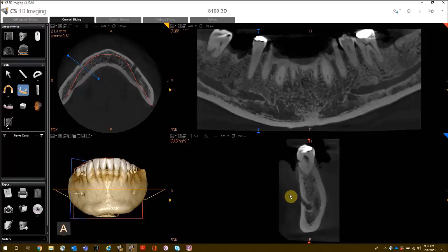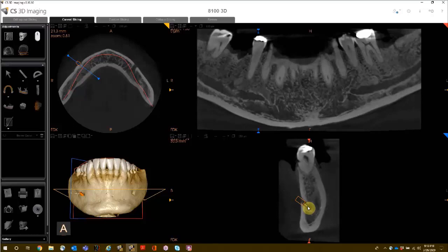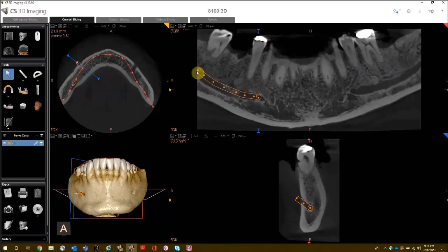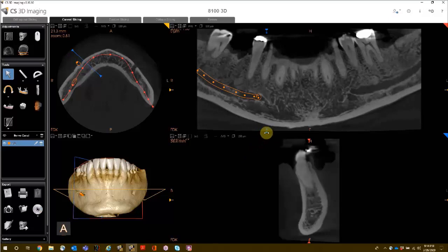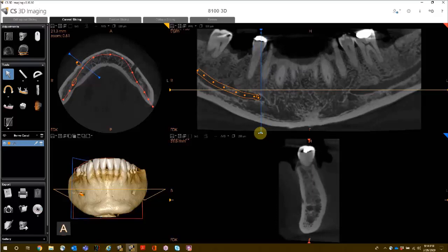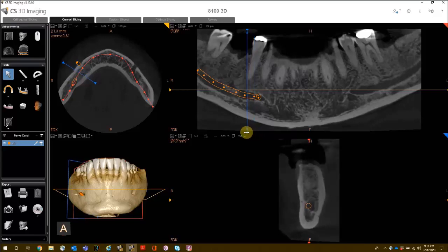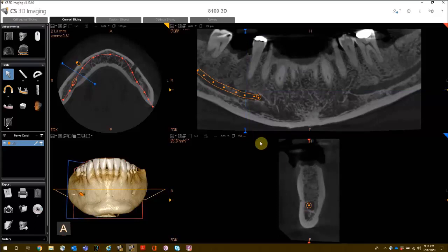Start the trace in the lower right view using single left-clicks. Then, without clicking, continue to trace the nerve in the reconstructed panoramic view. Double left-click when you are finished. To verify that you have traced the nerve correctly, slide your oblique coronal handlebar along the orange control points in the reconstructed panoramic and verify in the lower right screen that the control points are in the nerve canal as they should be.